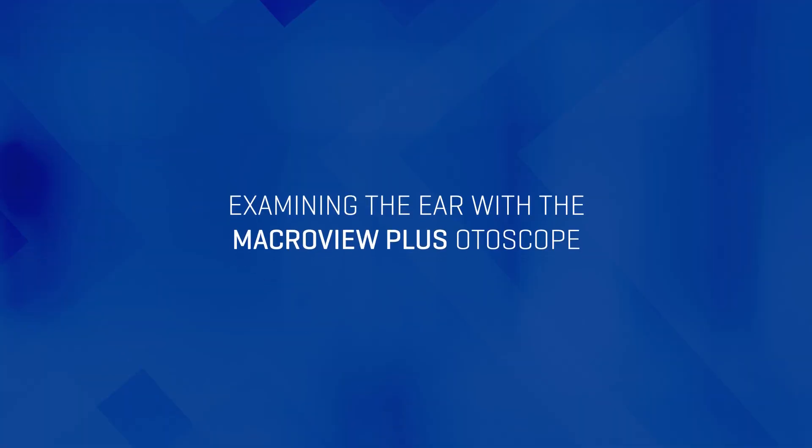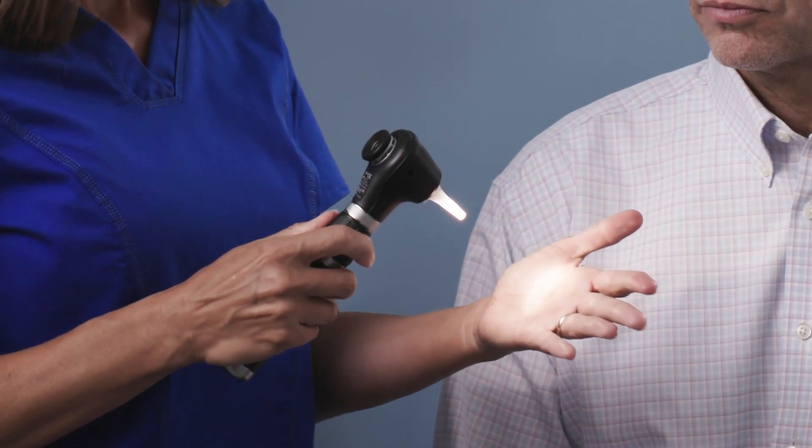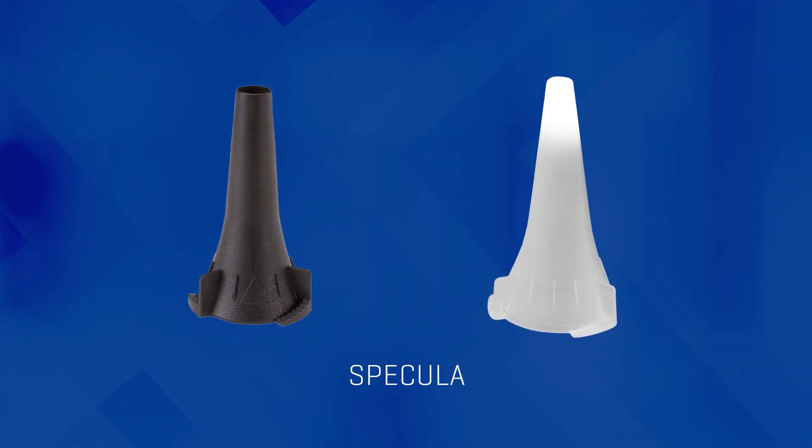Now let's move on to the exam. With any ear exam, you will want the patient to sit down and slightly tilt their head away from you to obtain easier access to their ear. Attach an ear speculum sized to best fit the patient. Disposable specula for the MacroView are available in a variety of sizes.